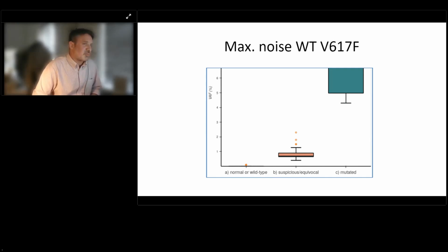So since bringing this to service, we haven't actually had a single false positive come through, and we've got this ddPCR test that we're able to use for confirmations of those very low level samples that return a positive result. It's been so good actually that we're probably going to retire that ddPCR based test because we just don't need it. If our NGS assay returns a variant at 0.6%, the ddPCR tells us it comes through at 0.6%. So we're very happy with the background noise on this, which was our main concern, I think, moving to a PCR based NGS assay.